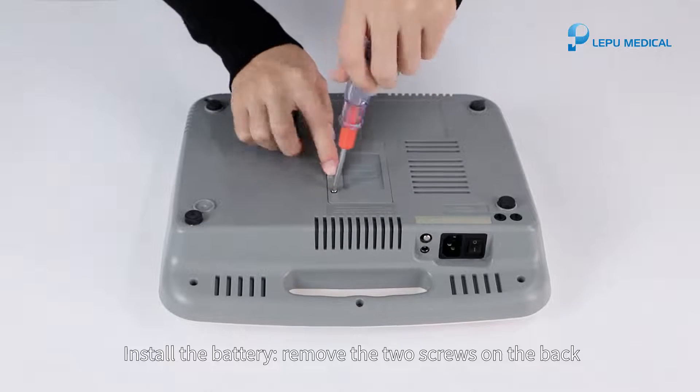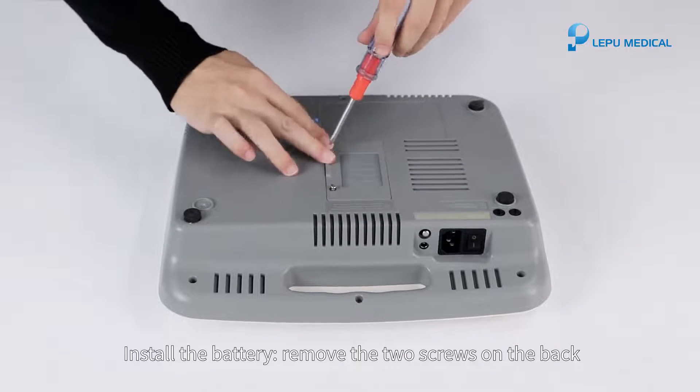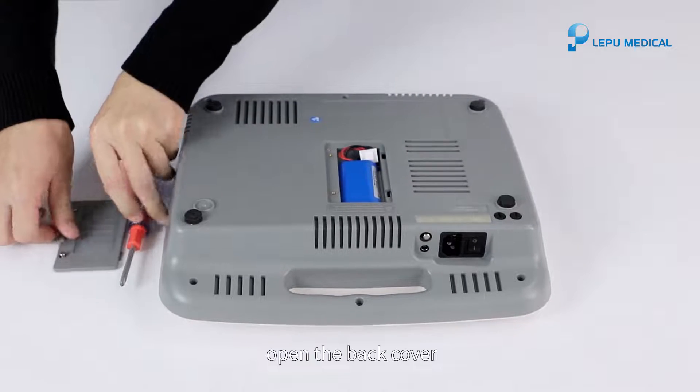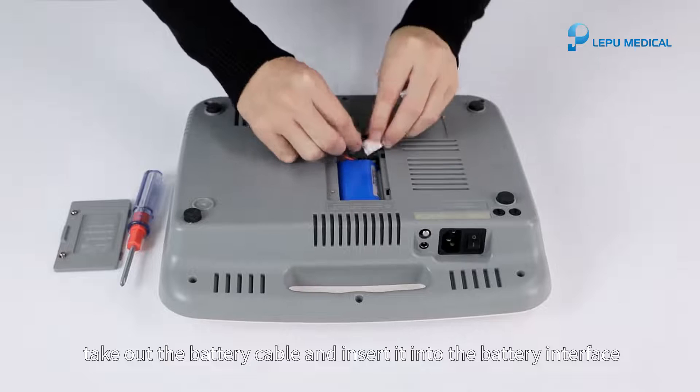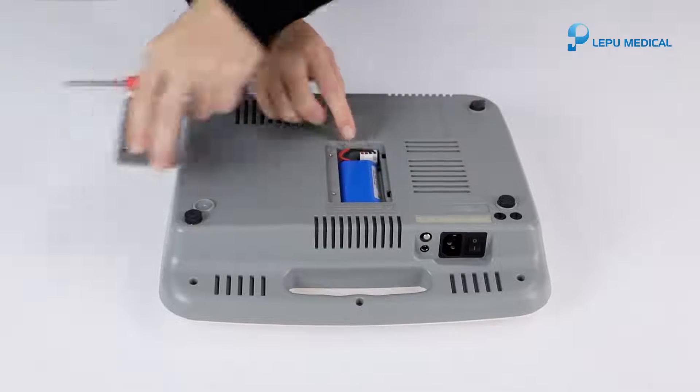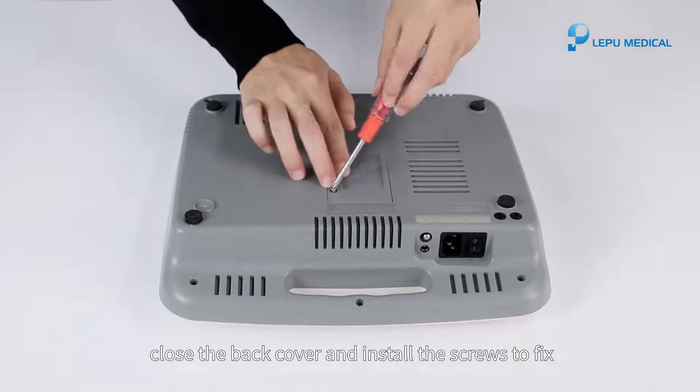To install the battery: remove the two screws on the back, open the back cover, take out the battery cable and insert it into the battery interface, then close the back cover and install the screws to fix.